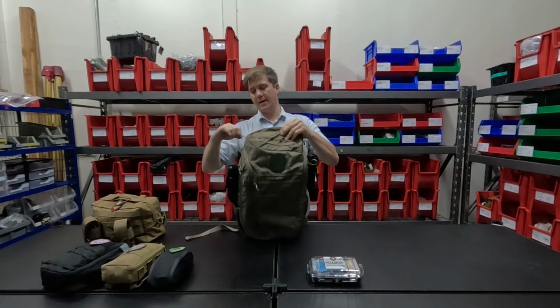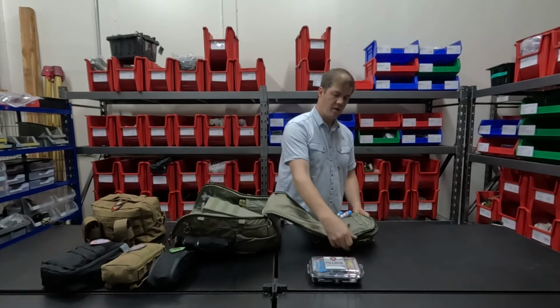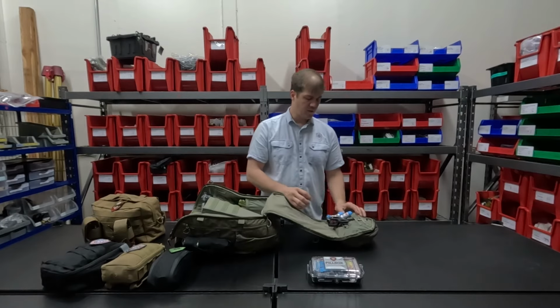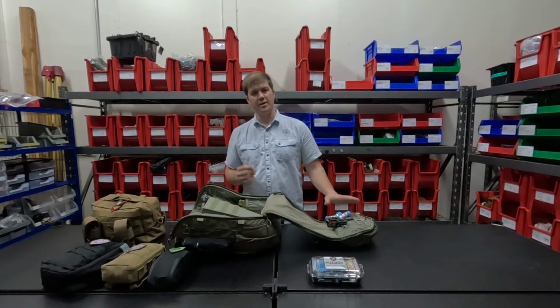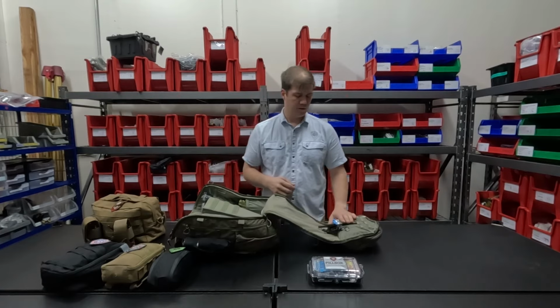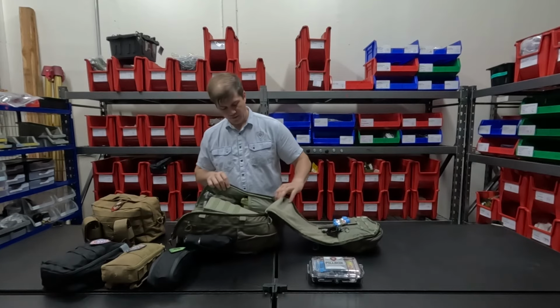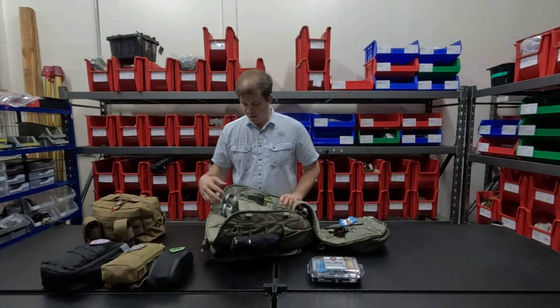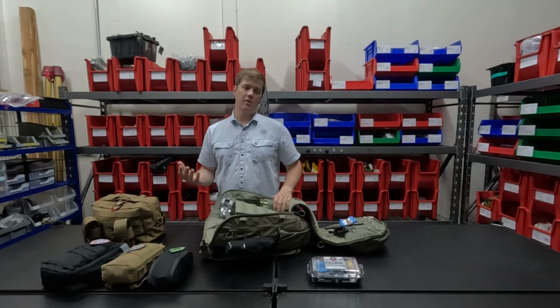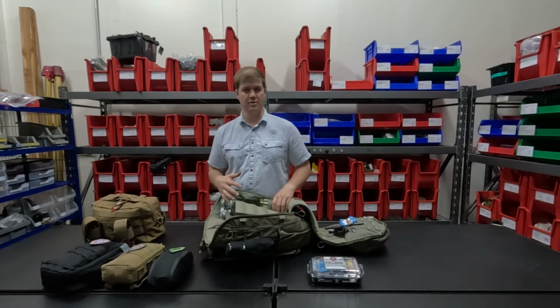Once we open up the bag itself and dive a little bit deeper into it, on the lid we've got shears for us to be able to get access to a patient's injuries. We've got a Sharpie if we need to take some notes. We've also got a variety of gloves here for us to be able to take care of ourselves and stay healthy. As we dive into the bag on this side, we've got a couple more tourniquets because we also follow under the similar mantra of 2 is 1, 1 is none. So we like to add multiple into most of our kits.